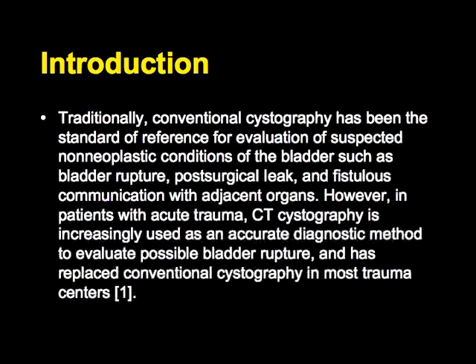One of the things we learned, of course, in that scenario is if you're going to do CT of the bladder, it was not enough to give IV contrast and wait for the bladder to distend. You would miss a lot of injuries. To really get a good look at the bladder, you need to have a dedicated study where you put contrast in the bladder. You can use air for select applications, but typically contrast is the way you want to go.